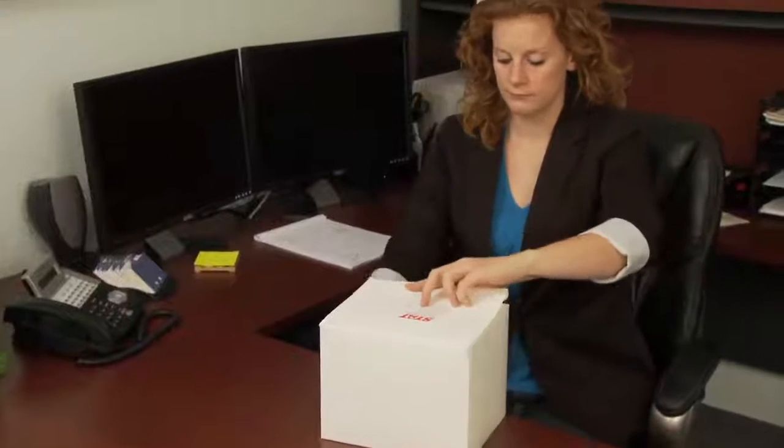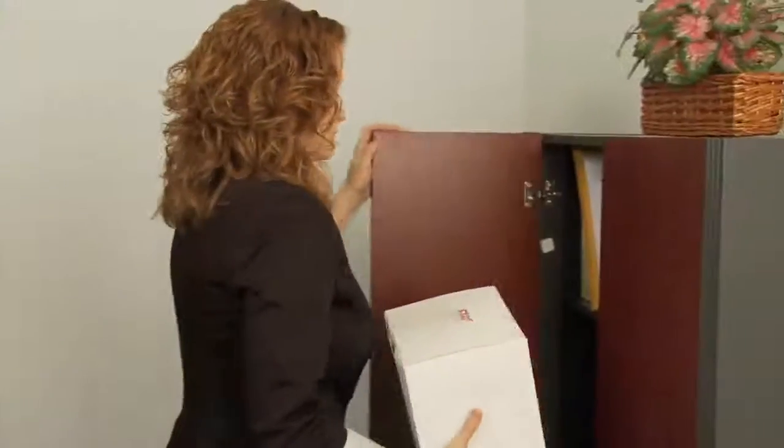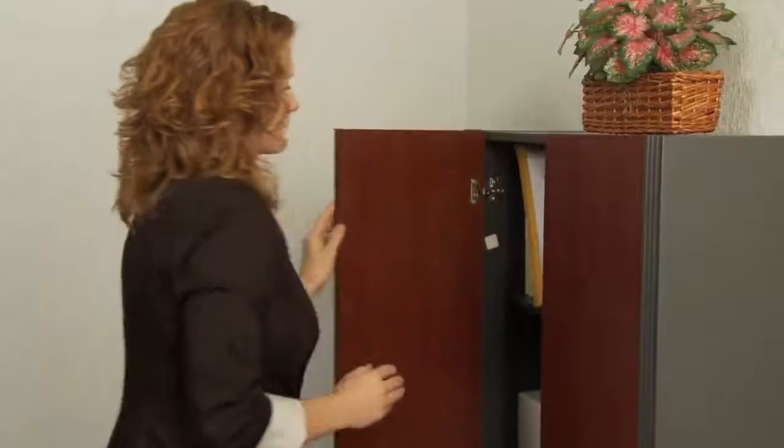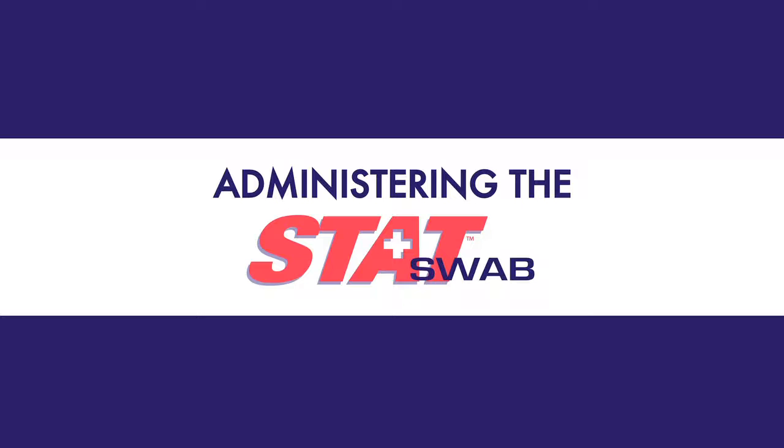To properly store StatSwab tests, keep them at room temperature. Do not expose tests to hot or freezing temperatures for a prolonged period of time. Adhere strictly to the expiration date on the foil pouch, and do not use tests beyond that date. Also avoid opening the foil package until it is time for the test to be performed.